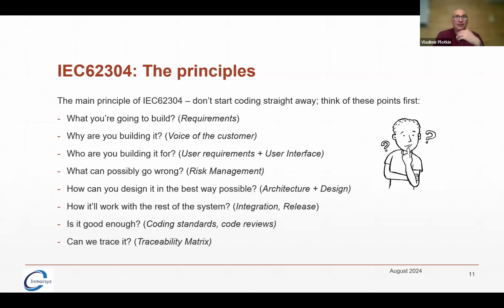If your final device is really heavy, users need to be able to operate it. It should be repairable, and should be testable on the production side. Technicians should be able to access certain features, and it will go into your software requirements. For example, the technician interface. So lots of things to be considering here.